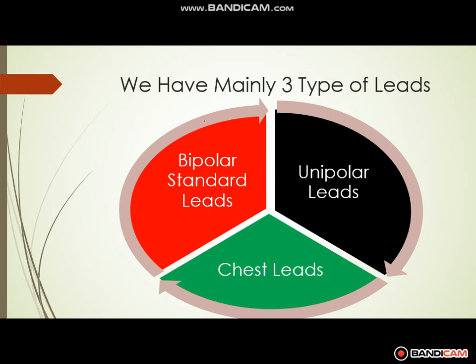So welcome back. We'll start with the types of leads. How many types of leads do we have? Mainly we have three types of leads: bipolar standard leads, unipolar leads, and chest leads. So what is important for a doctor to know?